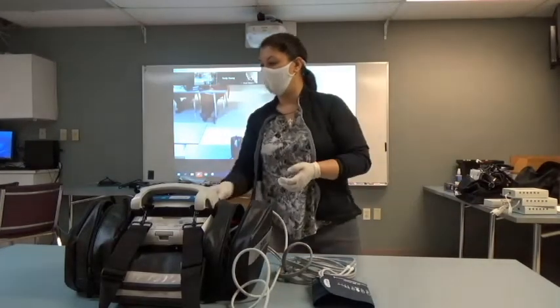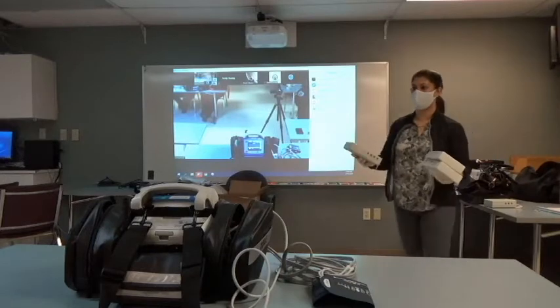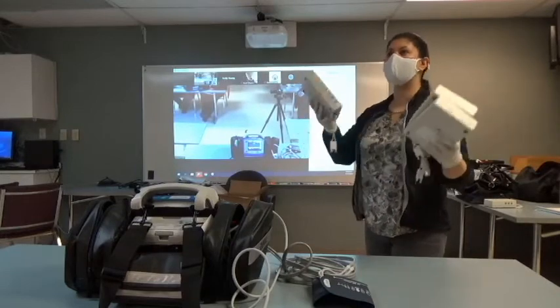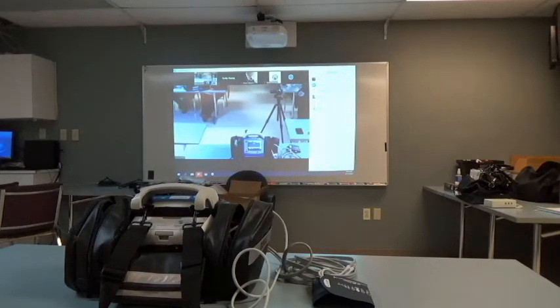Okay. We talked about your home button. I'm going to pass out some rhythm generators. I don't have a ton. The screen's really grainy. I don't know that they're going to see off of mine, so I'm going to pass these to you guys. For those of you that get a rhythm generator, please go ahead and put your four lead on. Here, we have one more coming. You do? Okay. So four lead, and if you guys want to look together to see what's happening.